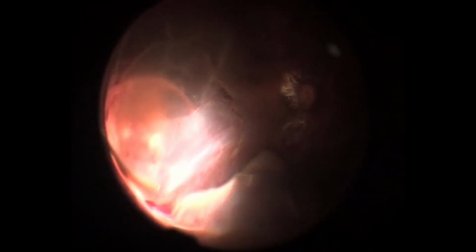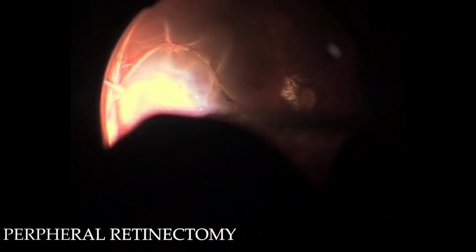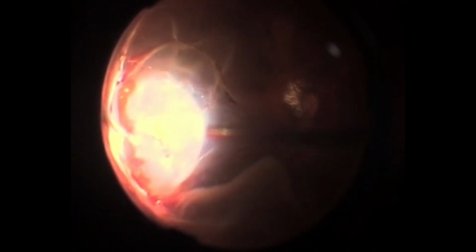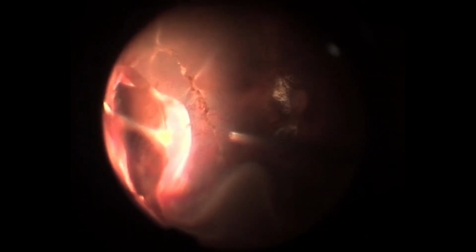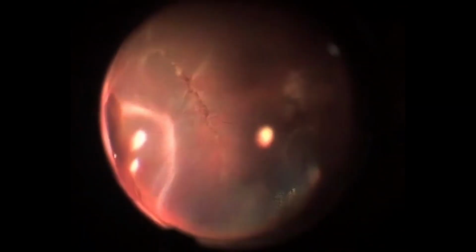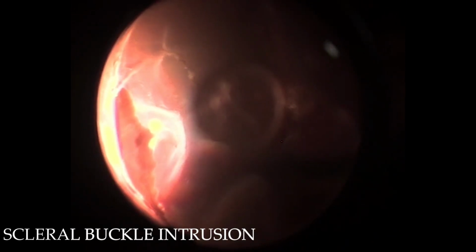At the inferotemporal quadrant, it was found to be subretinal migration of silicone oil. Peripheral retinectomy was done to remove the oil. Normally, oil should float up, but that was not the case here. The oil was removed mechanically. After removal of oil, buckle intrusion was noted.